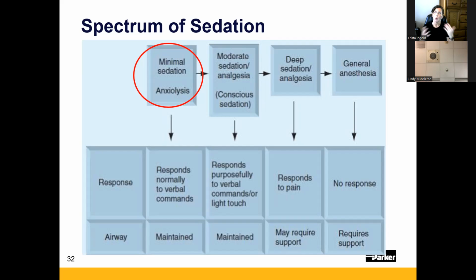All right. If you were to add an opioid or sedative to the patient's system, you would potentially change the sedation level to moderate sedation. And that in most facilities is outside of nursing scope of practice to administer. So even though a provider is always ordering this, and even though the patient is always self-administering it, nursing is typically the one on the books as administering this gas, the ones that are actually considered administering. Their scope of practice is minimal sedation, okay? And so you don't want to get into that moderate sedation.